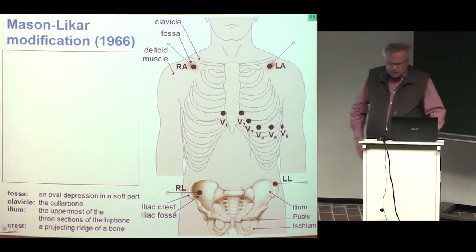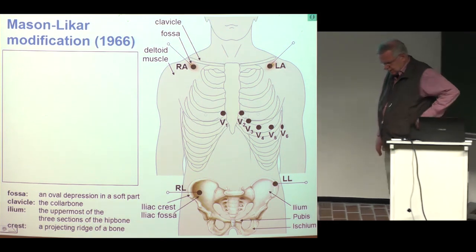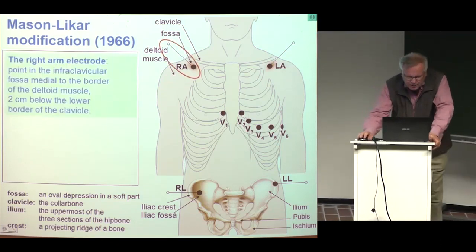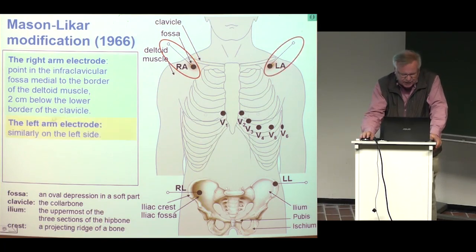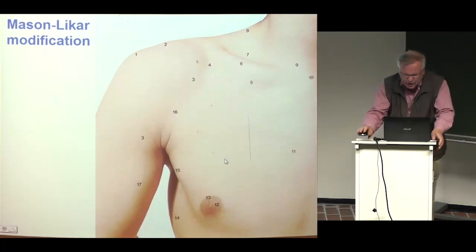Secondly, the muscular activity of the legs is avoided by recording the left leg here on the hip bone, because in this location it is just under the skin, and there is no muscle between the bone and the skin. If you try under your belt here, you find that the hip bone is just under the skin. There's no muscle, so that's a good point. So the right arm electrode point is in the infraclavicular fossa, medial to the border of the deltoid muscle, 2 centimeters below the lower border of the clavicle, the same for the left arm electrode. The left leg electrode is on the left iliac crest on the hip bone, and the right electrode is at the right iliac fossa. I show the anatomy here.